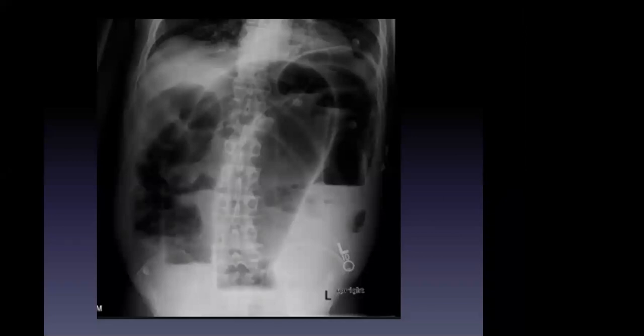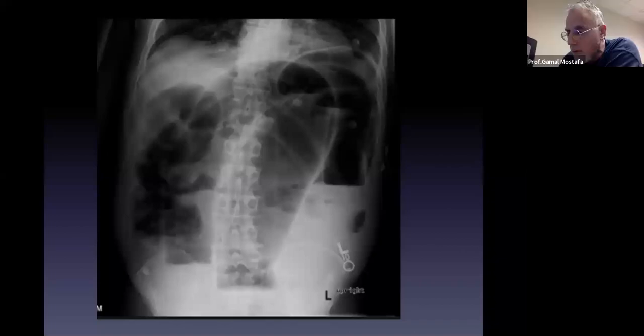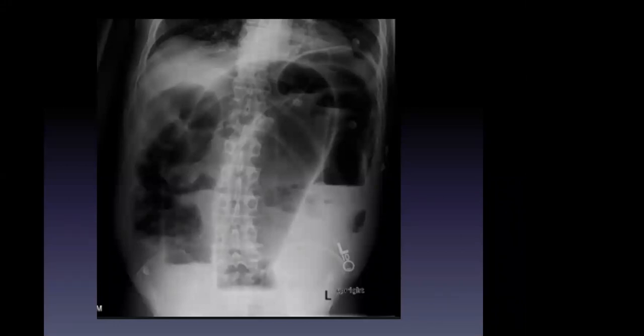If we're going to do primary anastomosis, we usually do a covering ileostomy for them. So let me see what we just did. We took a colostomy down and we have a staple line that can potentially leak. No, we're going to take the staple line with the specimen.